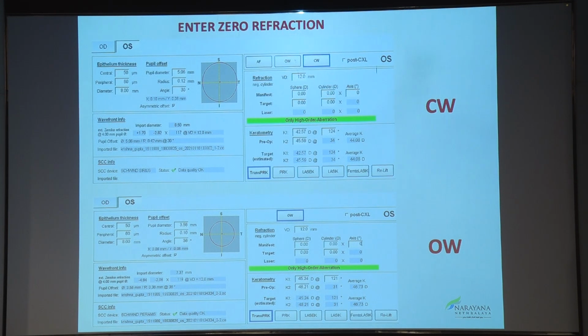Sorry, but to use the ocular wavefront, you will also have to have the aberrometer. Exactly. Earlier when you used Alcon, you used to get a Topolyzer and a Scheimpflug-based Oculyzer. So we used to have both, but the Topolyzer was great while the aberrometer was pathetic. So what happened was everybody discarded it, even we had it. So the challenge was not the technology; the challenge was the machine which could capture the image.